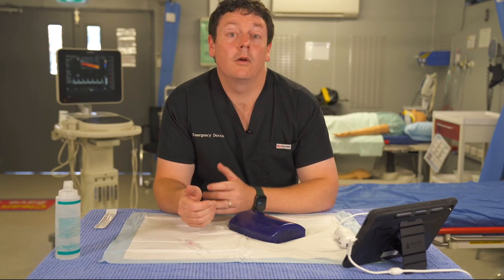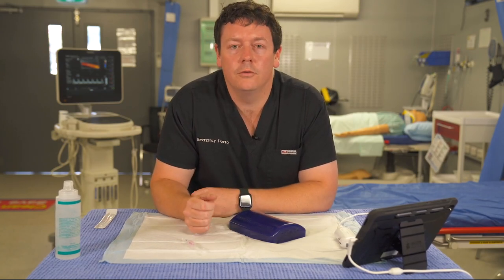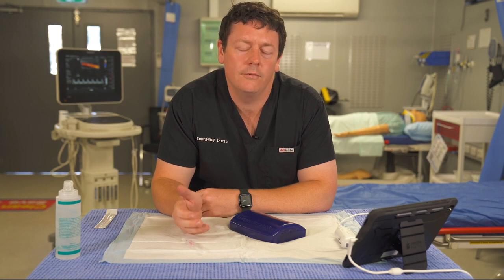We're not going to cover the infection control principles of vascular access or needle guidance here — please review your local protocols, as this is vitally important particularly for deeper structures and central venous access. What we'll focus on is the steps of following the needle through and trying to hit a target.